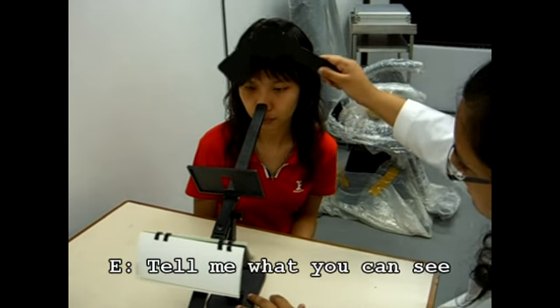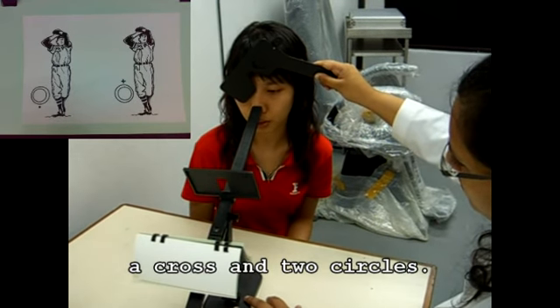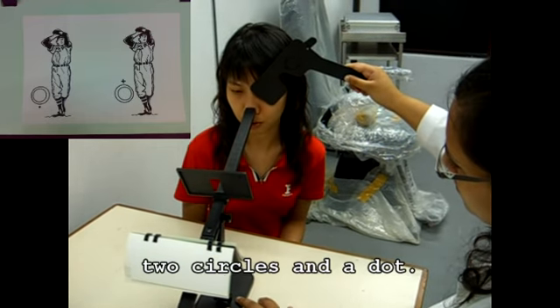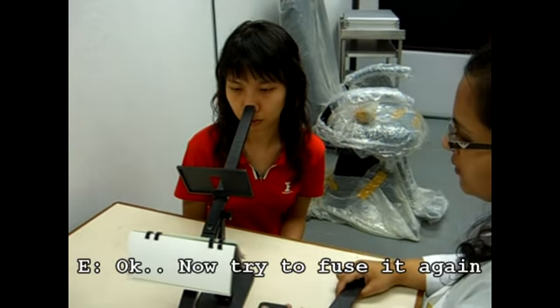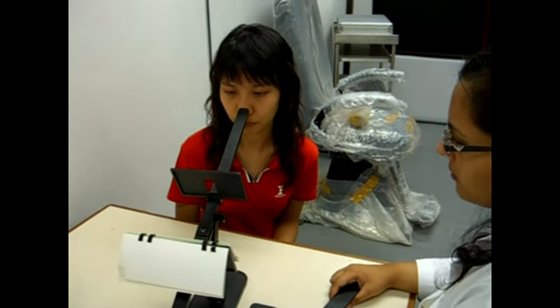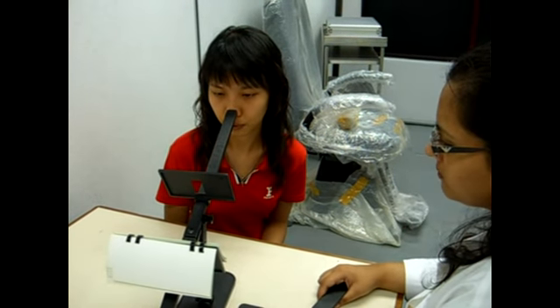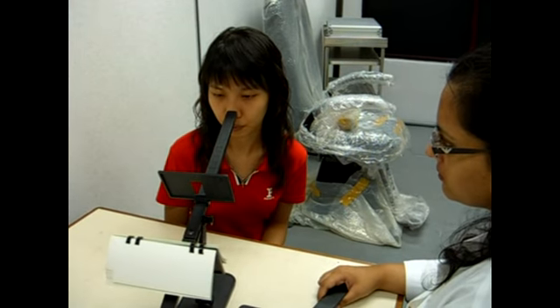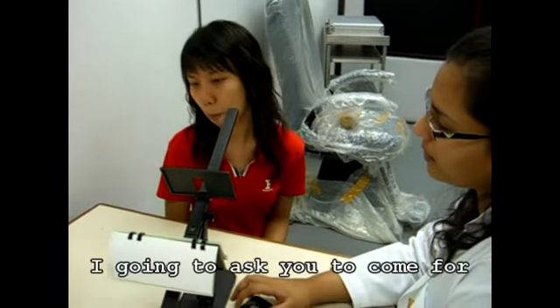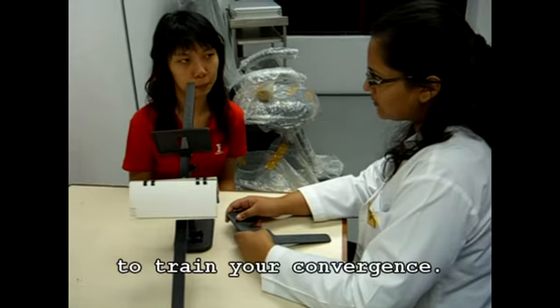Tell me what you can see right now. A baseball player, a cross, and 2 circles. Baseball player, 2 circles, and a dot. Okay, now try to fuse it again. Cannot fuse. Okay. So what we're gonna do is I'm gonna ask you to come for a next visit to try to train your convergence.